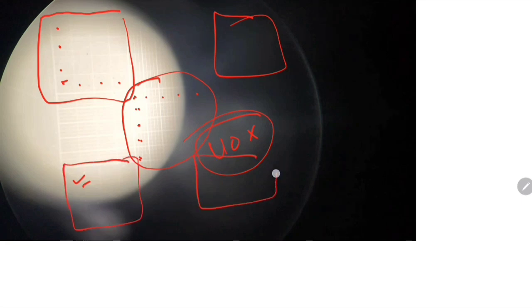This is not focused properly. 1 2 3 4 5, and on this side you will get another WBC area. So these are the WBC, WBC, WBC and WBC, and this is the RBC. Here we are going to count these 1 2 3 4 and this 5th area. So 5 RBC areas we are going to count.